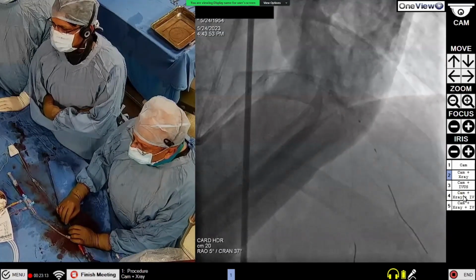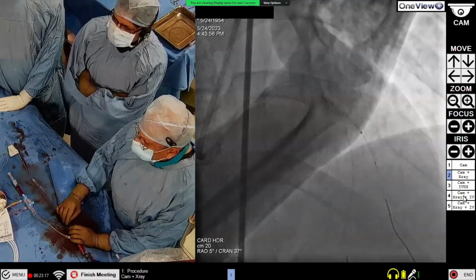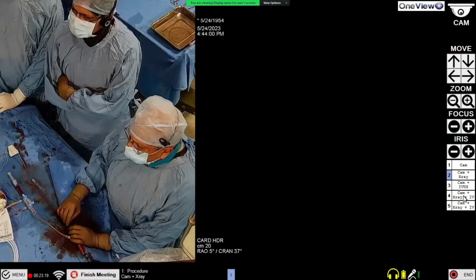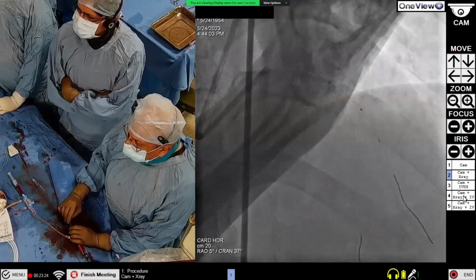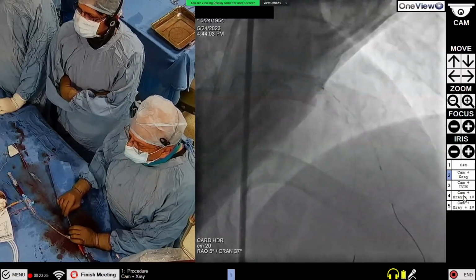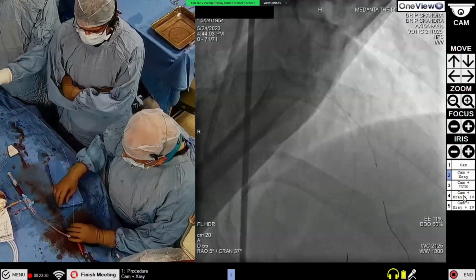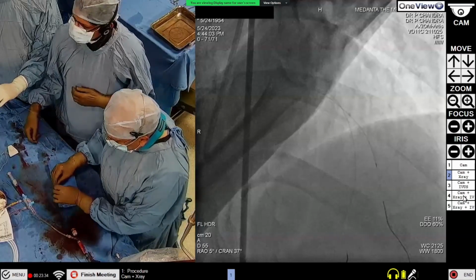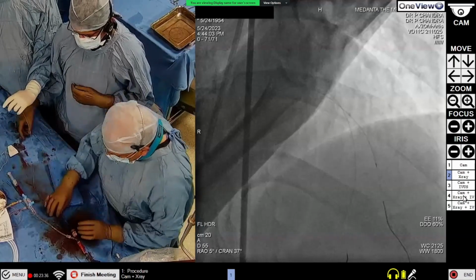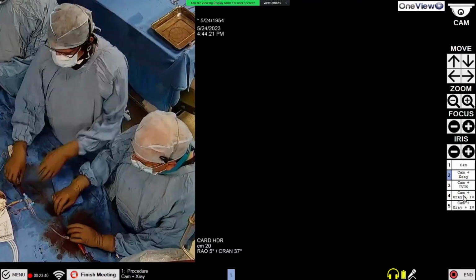The only other way is we can do a shock wave in diagonal also. But I think doing that will be too much, too many shock waves, because here we can only take a 3 millimeter. Yeah. So, okay. So this is dilated already now, and okay, check it.